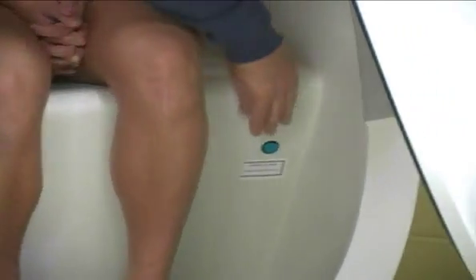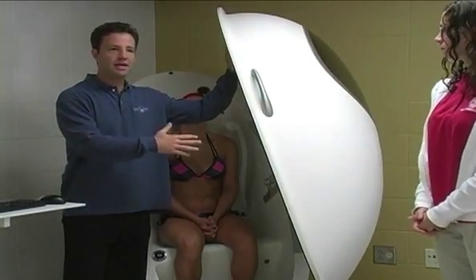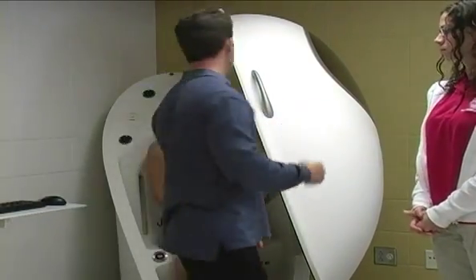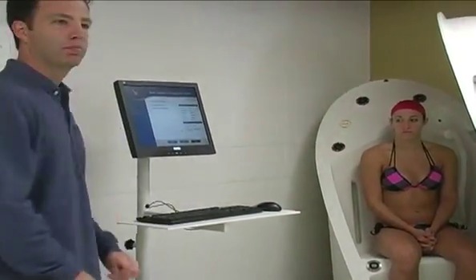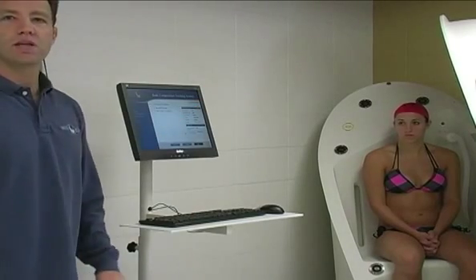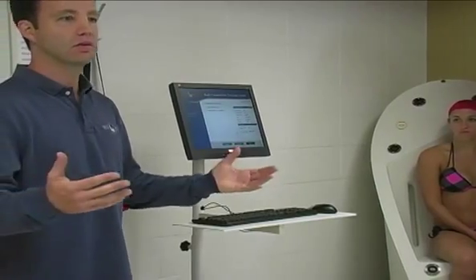You're not trapped. She would simply press this. This disengages or de-energizes the magnets, and you could simply walk out. You can also just hit escape, or you could hit cancel on the BOD pod, or you could just pull the plug. But those are ways that if you needed to discontinue a test for whatever reason, you can do that. So. Okay.